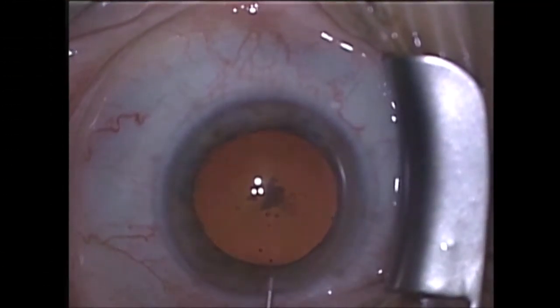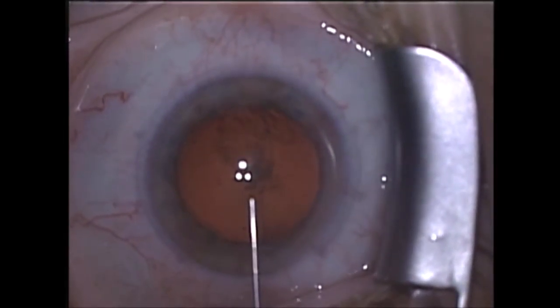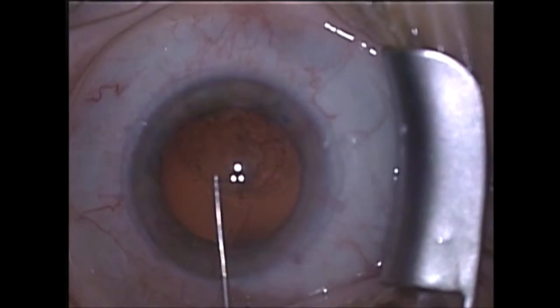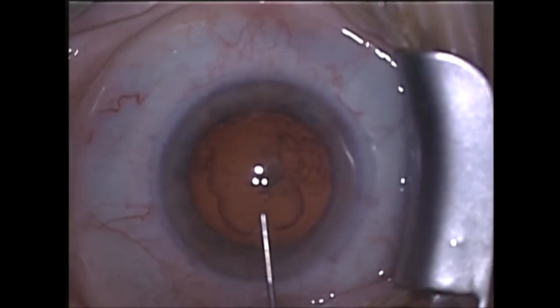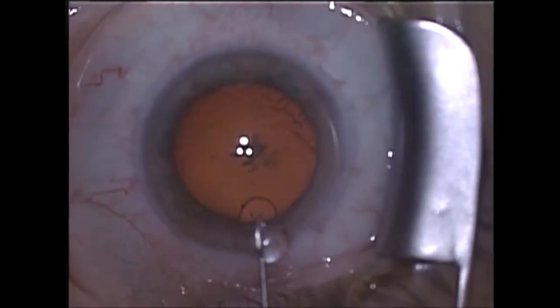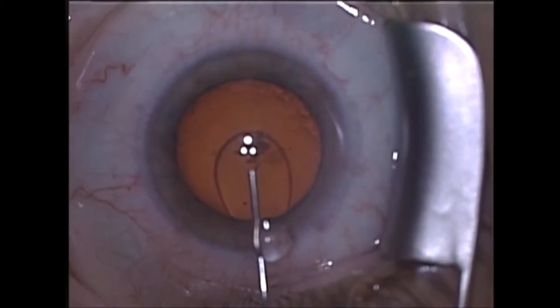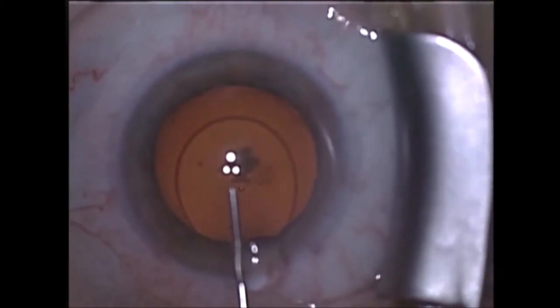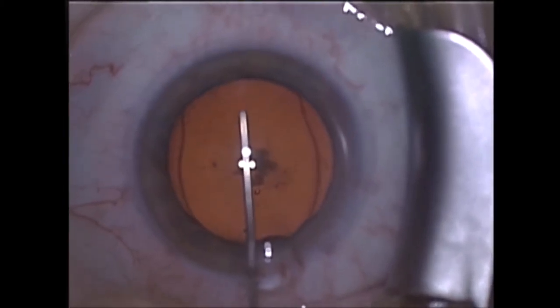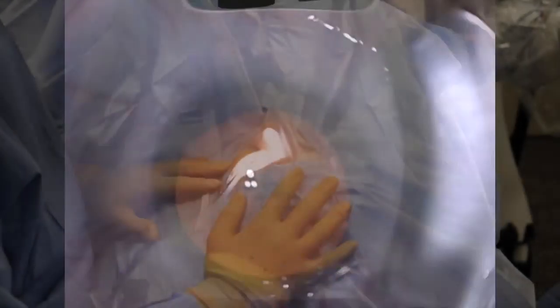I then employ Arshinov's softshell technique to protect the ocular structures. A layer of a viscodispersive OVD is initially injected to coat and protect the corneal endothelium. A second deeper layer of a cohesive OVD is then injected to achieve two objectives: it acts to tamponade the dispersive OVD against the cornea anteriorly, and it is advanced into the angle to create and maintain a safe workspace to facilitate safe entry and accommodation of instruments during surgical manipulation.